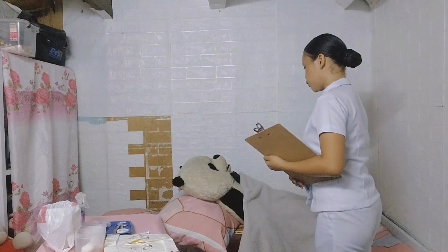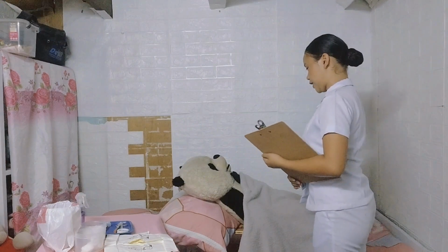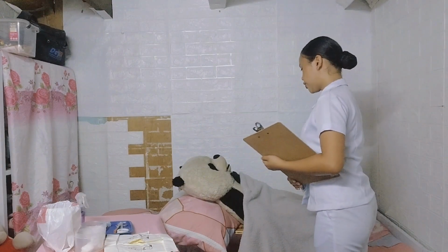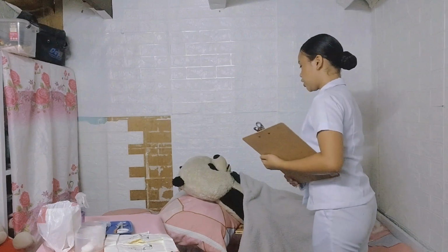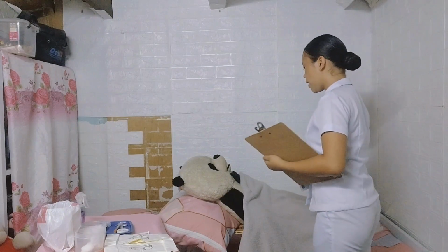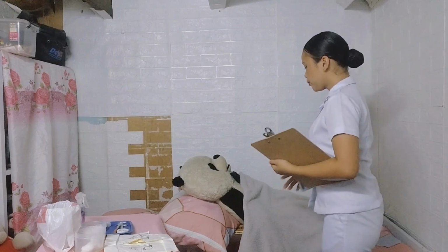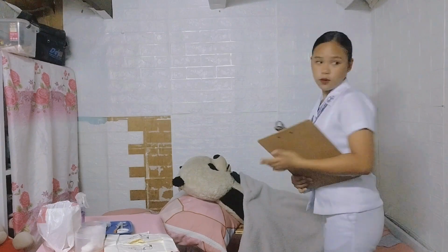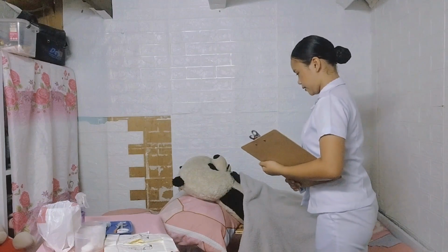This is for us to know if you have any allergies and of course to know your skin sensitivity. This may hurt a little, sir, and this will cause a bleb like a mosquito bite. Is that okay with you, sir? Do you have any questions or clarifications? Before we begin, sir, is it okay if I close the door so that no one from the outside will disturb us?